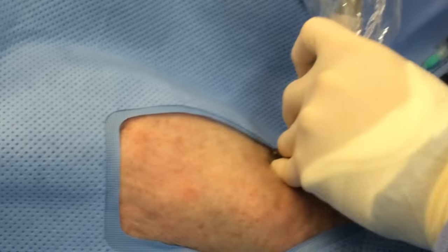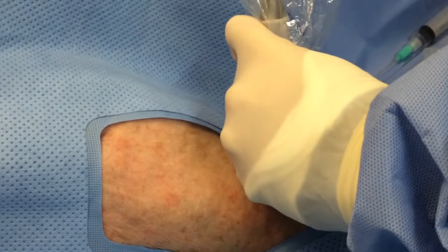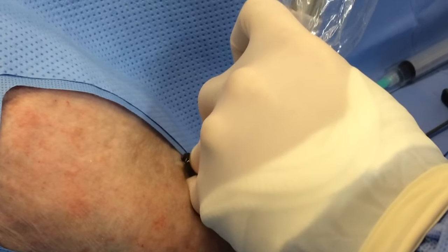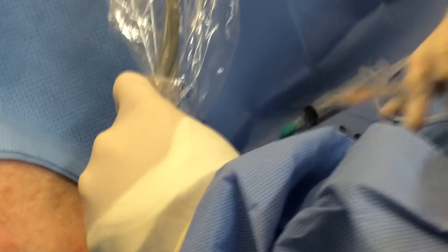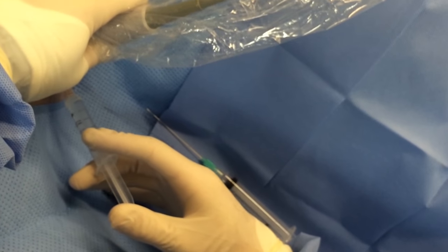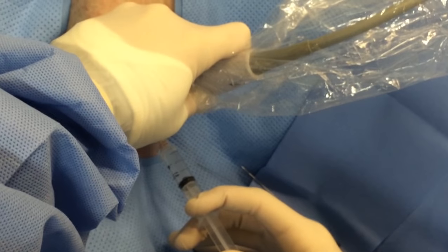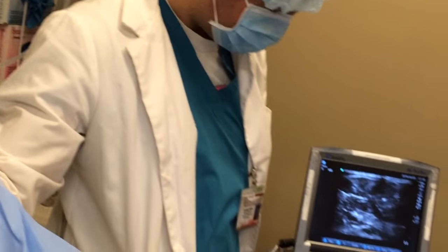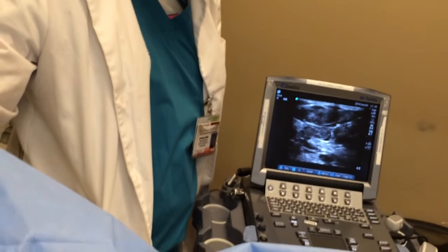So I figured what I'd do is show you the actual procedure first and then talk about it a little bit. Here's Rory with an ultrasound identifying a vein. He sees a nice big plump vein. He's injecting local anesthetic from the kit. He's not going to use his whole syringe — he's going to use about half for the skin anesthesia. We'll talk in a bit why you want to save about half of that syringe, because you're going to need to anesthetize a different spot later on. There's the big fat vessel.